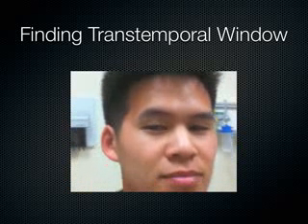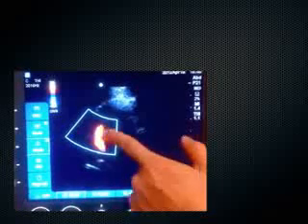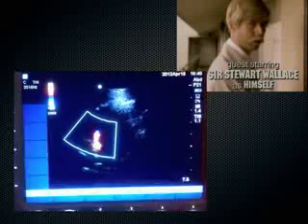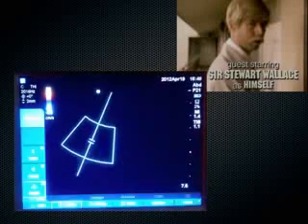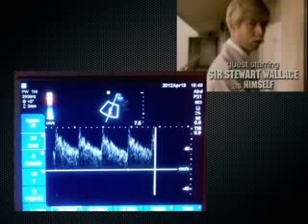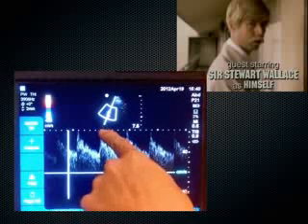So those are those 4 windows that you just saw Alan clearly identify. Now, Alan's going to show you the important vessel in the brain here, the MCA. I'm going to color mode, and here I see the MCA and the ACA, and what I'm going to do is put Doppler on. I'm going to hit Doppler again, and what I get is essentially MCA Doppler on pulse wave. This is the systolic flow, and this is diastolic right here.